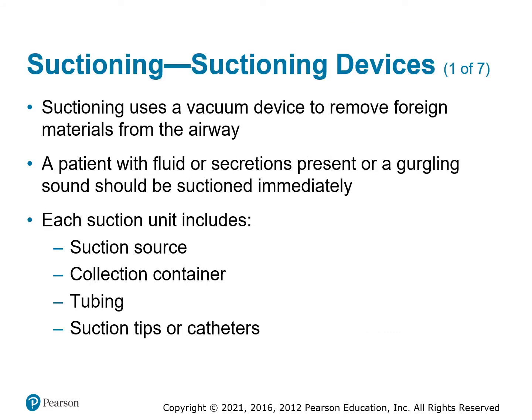Suctioning uses a vacuum to remove foreign objects. You should understand how suction works. You need to have a source. You need to have somewhere that the container is, some sort of tubing, and then the tip itself.